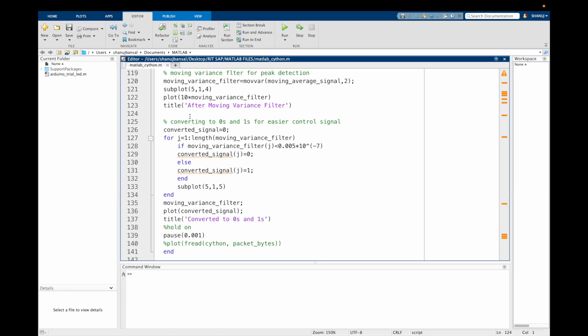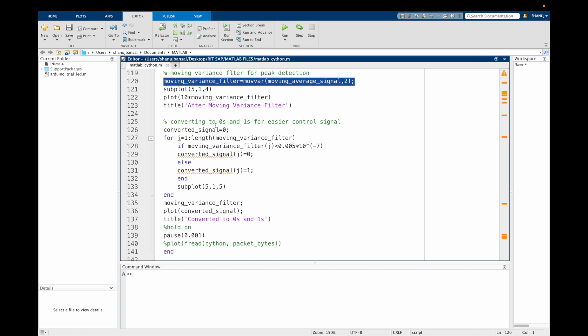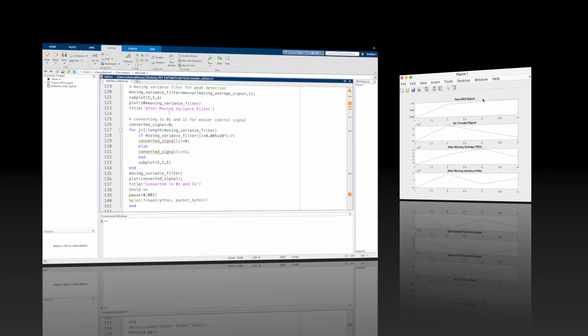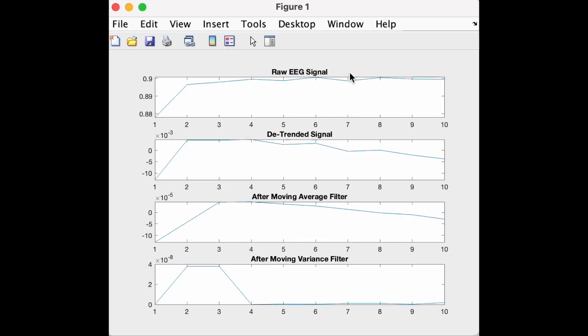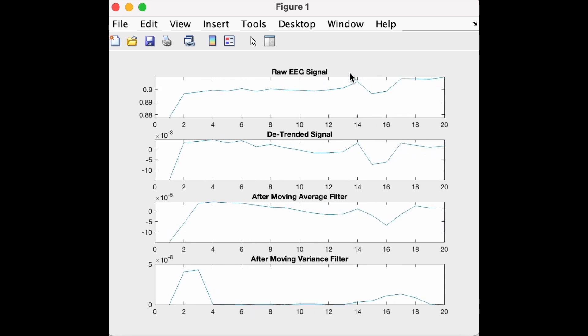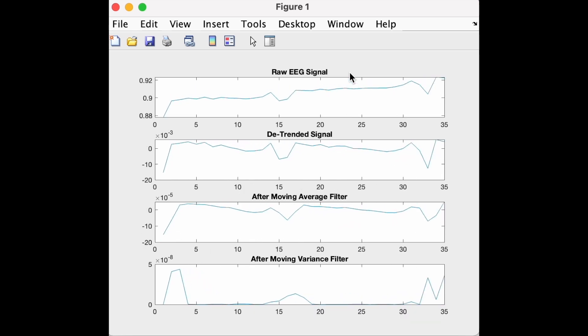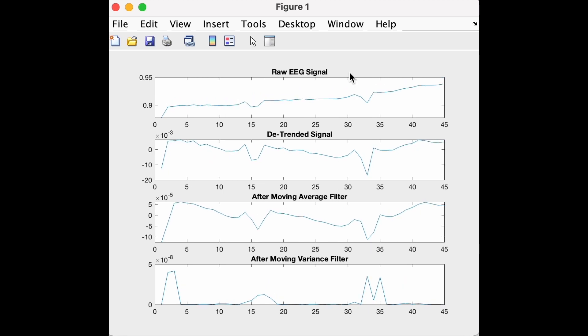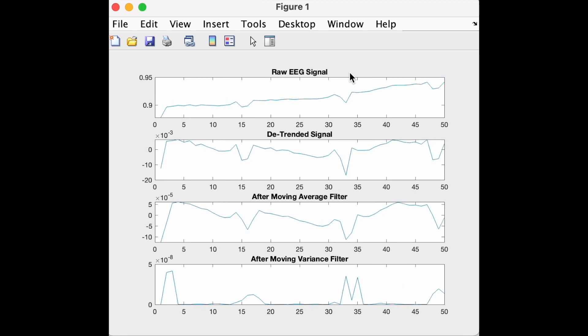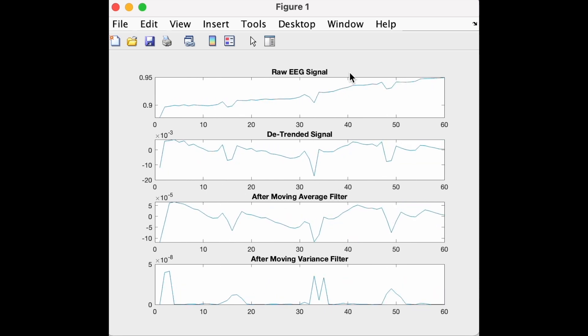Now to detect the peaks, I have used a moving variance filter. This helps us to detect any sudden change in the data by finding variance in two consecutive values. Let's see how this works. We can clearly see that whenever there are peaks in the signal, there is a sort of peak in the filter output; else it is close to 0 or a straight line.